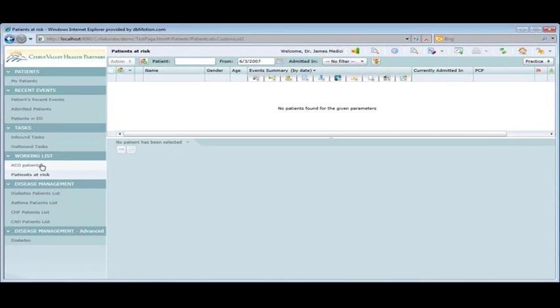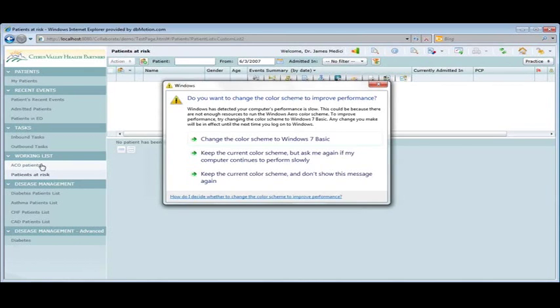Okay. Did you have any thoughts on that or value there? Well, I think about, I'm the director of the acute team in Sunrise for the demos, and for HIMSS, we had done a population health story and, you know, identifying certain patients at risk and talking to points of care director or care manager on how you'd be observing them and watching them. So I guess it's similar. Just wanted to know if you had it populated and what story workflow you had to go with it.